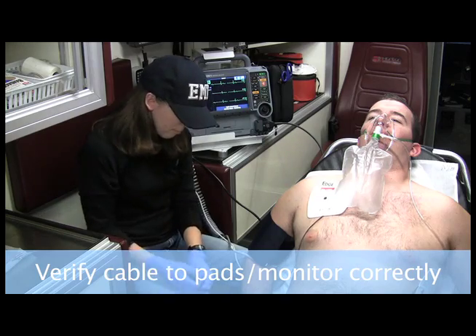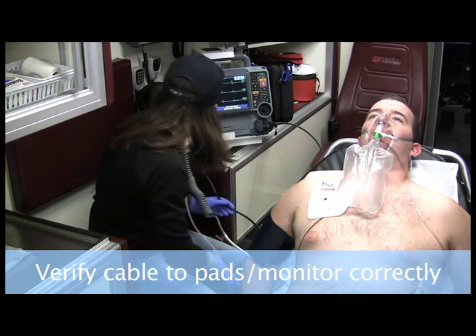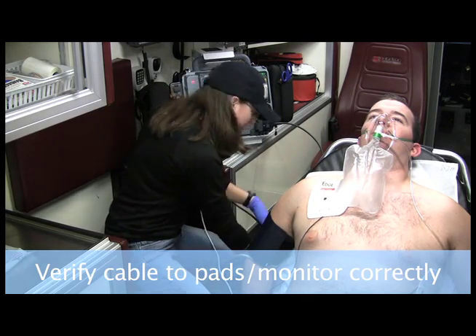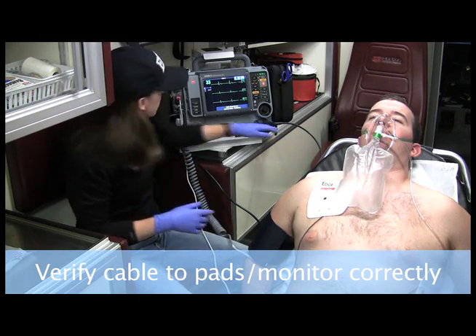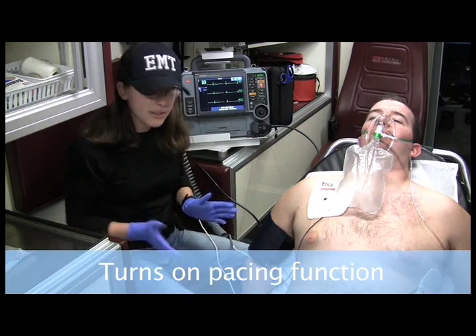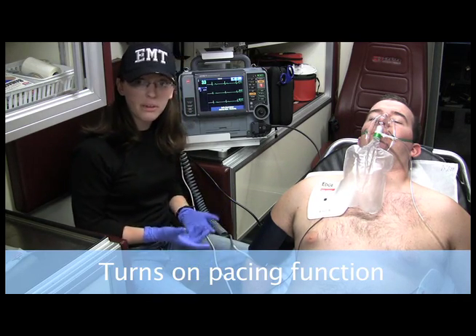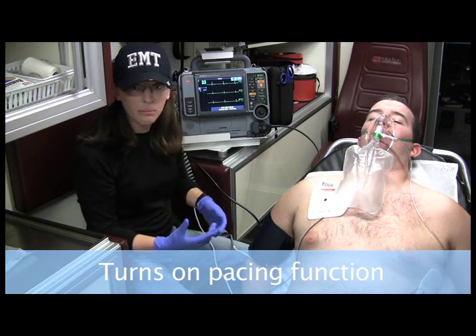Now that I have the pads in the correct location, I want to make sure that I'm hooking the pads up to the monitor. Make sure that it's hooked correctly, following the right wire — which it does. Now I'm all set to pace. If I got permission to give medication, I might think about getting medication now, or we can get it after we start pacing.